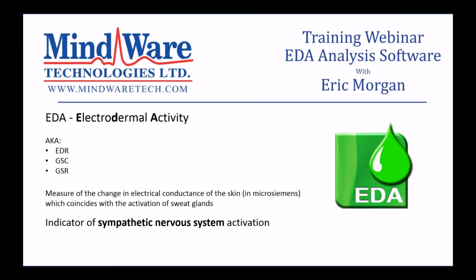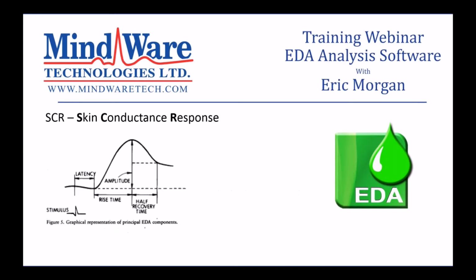And when we're analyzing EDA, we're looking at 2 main components of the signal. We're looking at the tonic component, which is sort of the baseline EDA level, and we're also looking at the phasic component in these responses, or SCRs. And a skin conductance response is just a change in the signal that increases a certain level or amplitude following a stimuli.